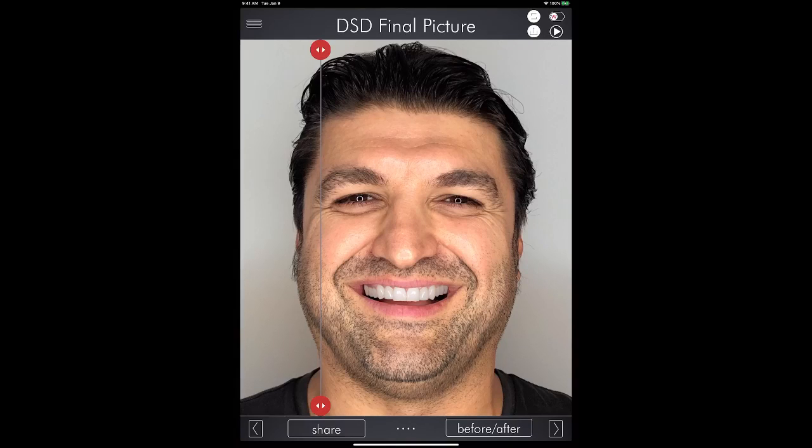You create a very aesthetic, very harmonic smile in the face of a female patient. The same procedure for a male patient is a little bit different because you have edgy smiles, right? You have patients that are super sporty. They have edgy facial characteristics.